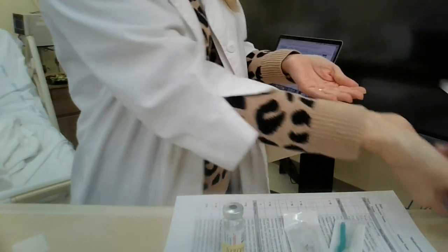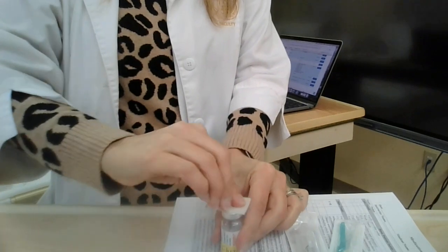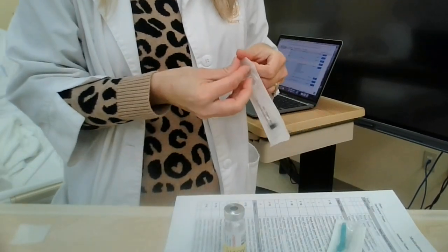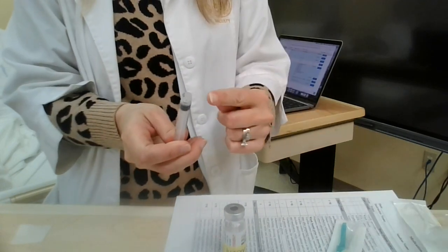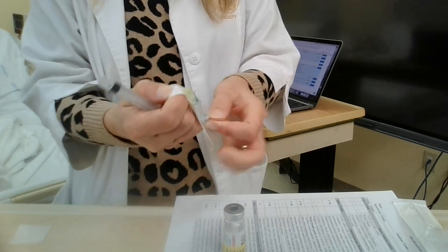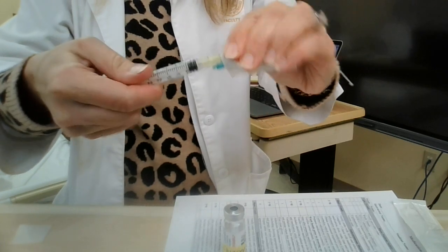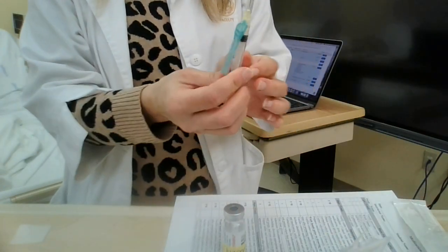So I'm going to, again, wash my hands and take a fresh alcohol swab and swab the top. And we do that to prevent any bacteria from getting into the vial. So remember, when you open this up, this end is sterile. We don't want to touch it, so kind of hang on to it. And when you open up your needle, that yellow part on top is sterile. So I'm going to connect the two, and you can go ahead and take your safety and pull it down to get it out of your way.